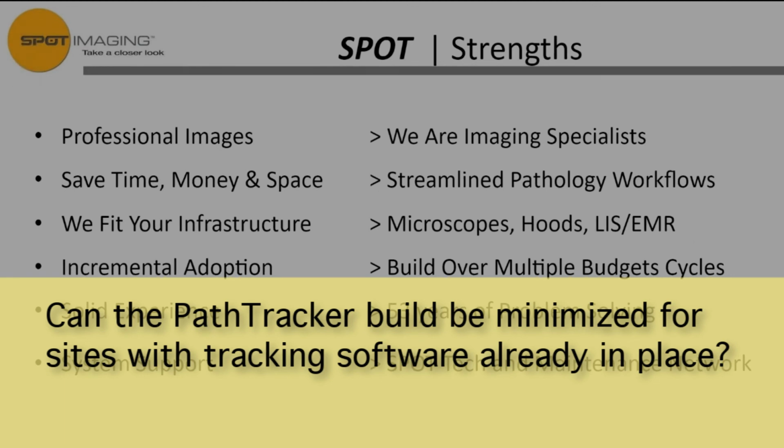And then at that point, I'm pretty sure we can purge the database so that we're not taking up a lot of space on the server, and just upload the scan data into the LIS.